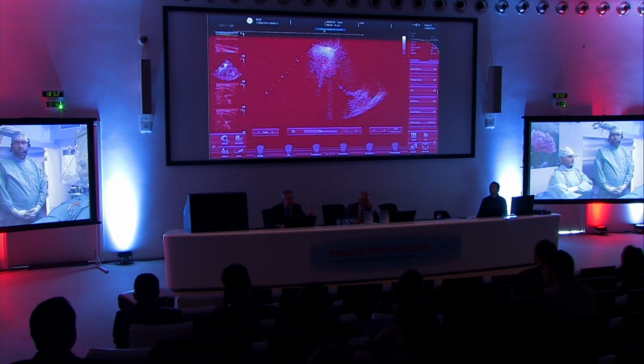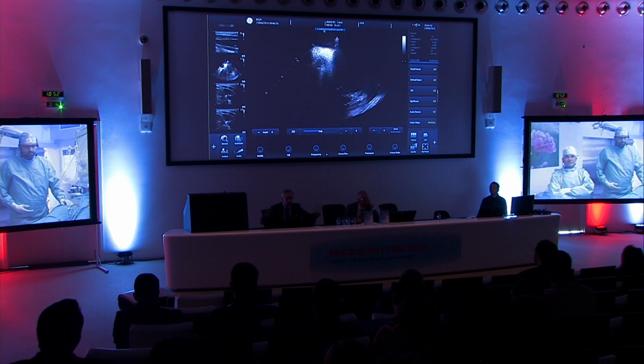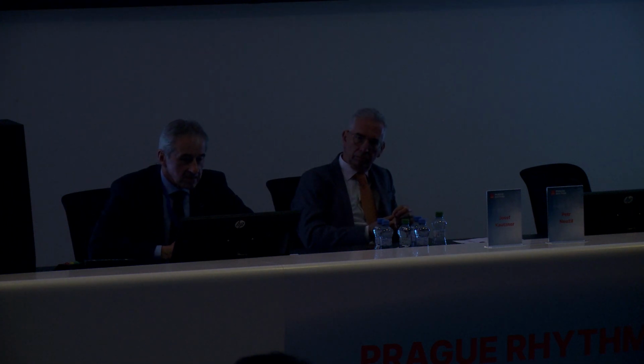This is a functional thing. One time it could be 10 seconds, could be 12 seconds, 8 seconds. So I don't think, even if a patient has syncope, they may not have a difference in duration, but nobody studied that. But we just wanted to stress that this test is very important because you can measure what you've done after every application, so you can minimize the amount of applications, the amount of ablations.